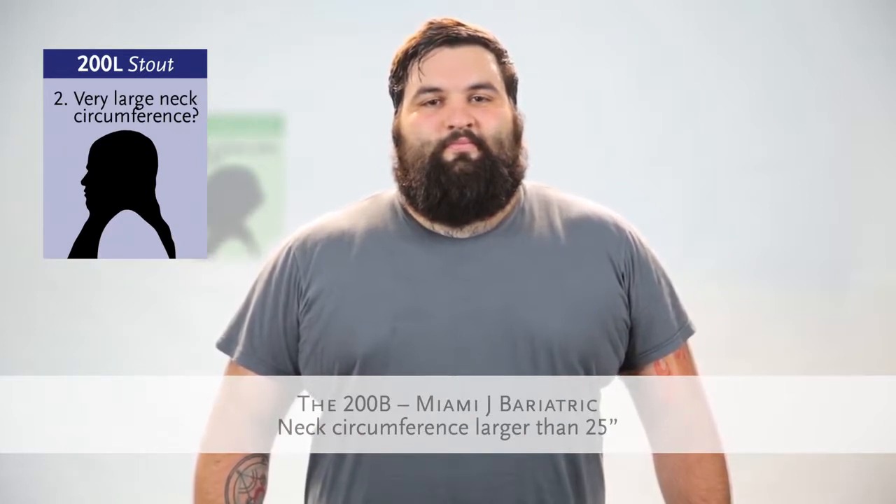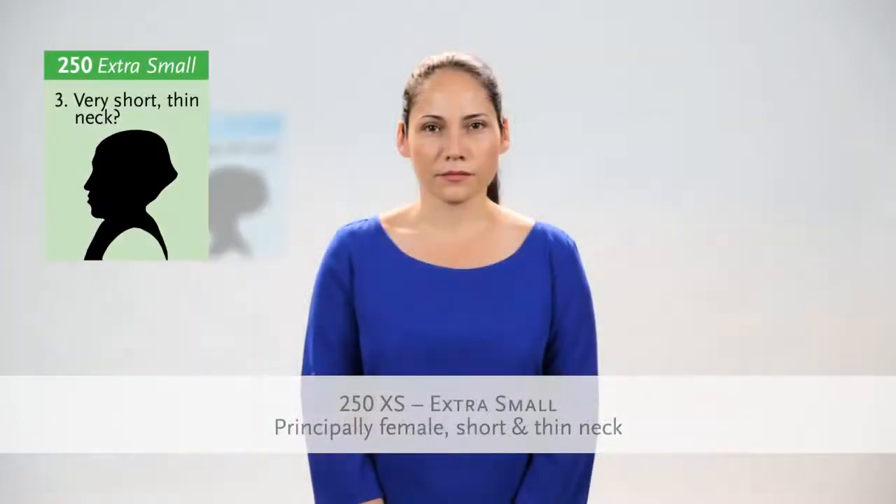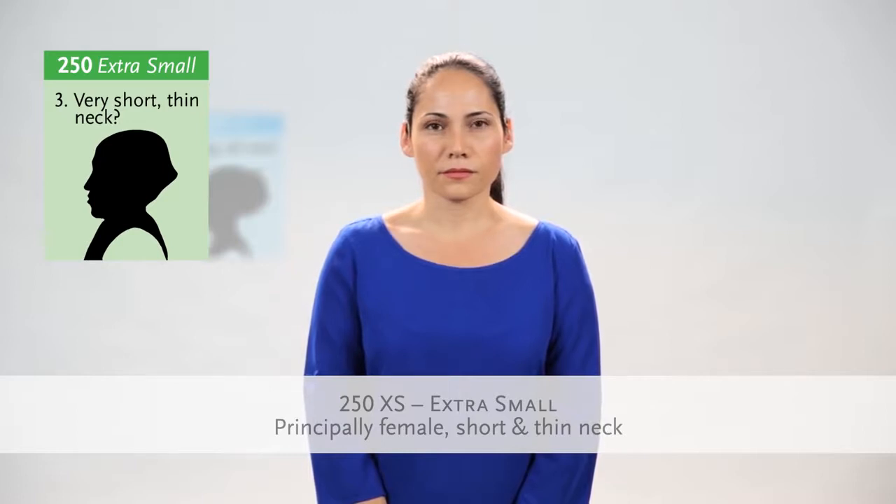Does your patient have a neck circumference of 25 inches or greater? Consider using the Miami J bariatric collar. Does your patient have a very short, thin neck? Although rare, the Miami J extra small collar size is principally used for females with a very short neck circumference and short neck height.